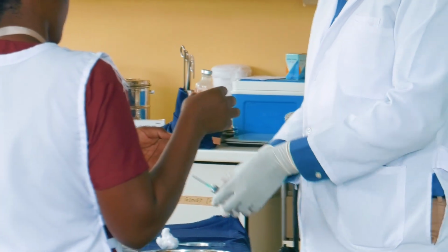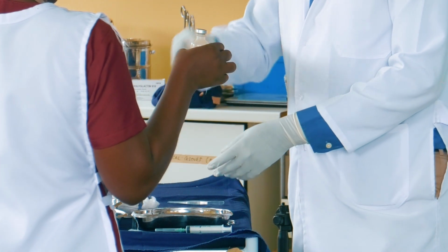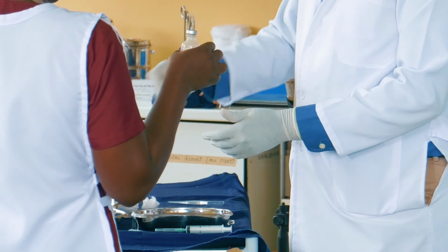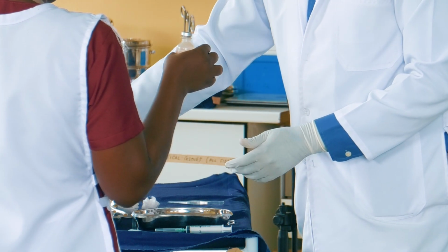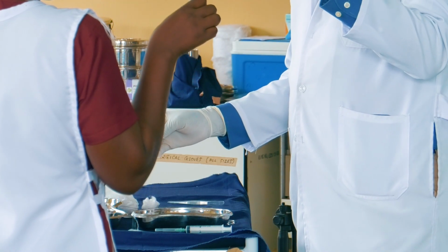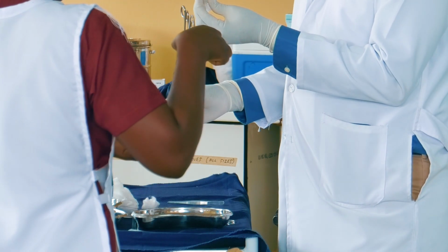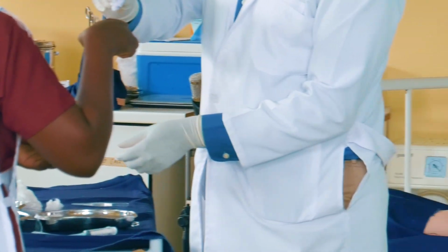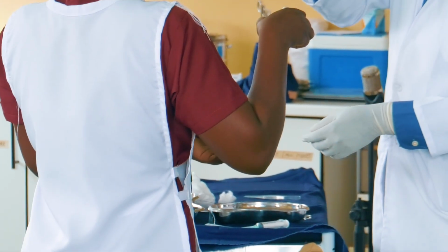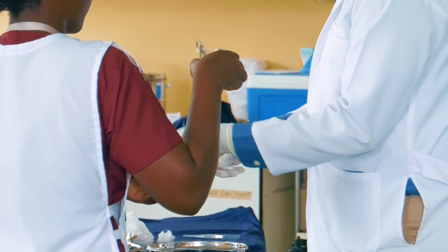What we do when getting this lignocaine, again, we need to swab this top part. We're supposed to have something that is intact, closed, and everything else. For now, since it's open like that, you show me, you put it like that. When she does that, I'll swab the part where I need to inject, to make it sterile. Throw it, then get your, so bring it closer.